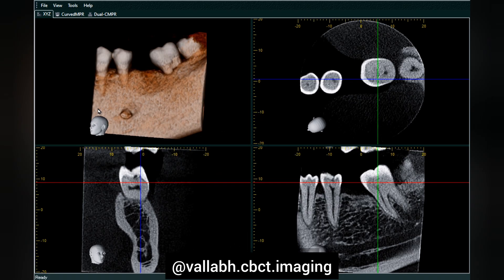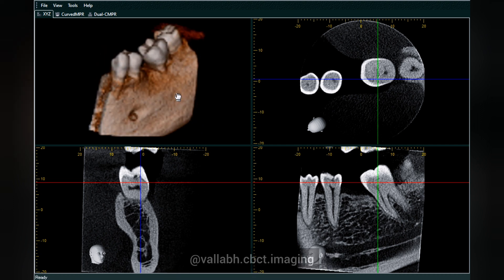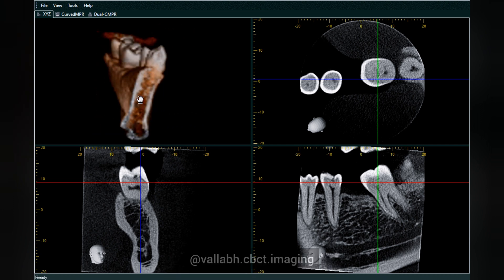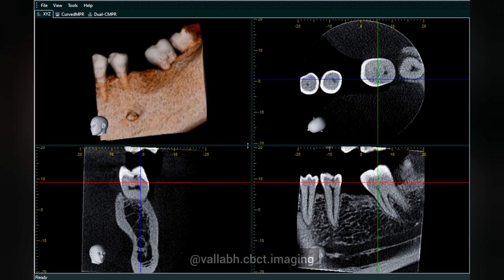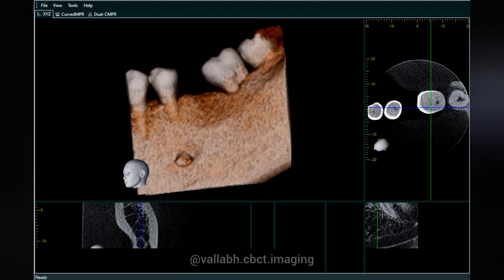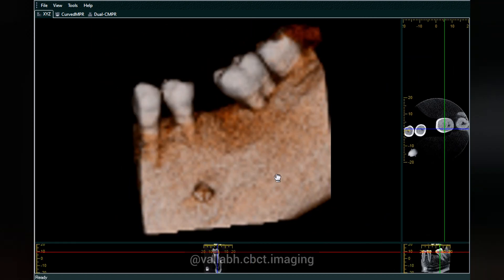Hello everyone, my name is Dr. Balap Chawla, and today we'll learn about the anatomical landmarks as seen in the 3D volume rendering image of a sectional CBCT scan. We will be focusing on anatomical landmarks only on the 3D volume rendering.